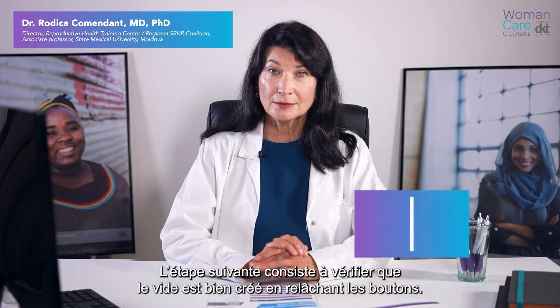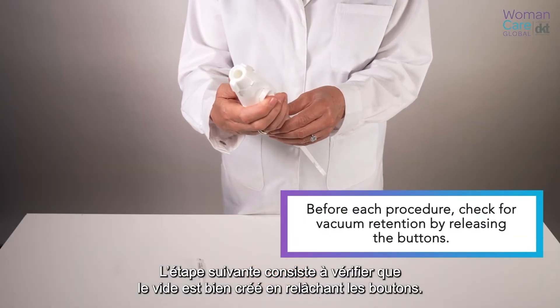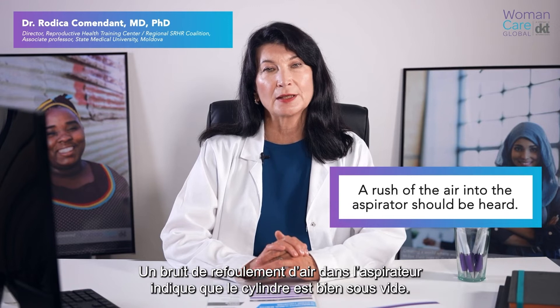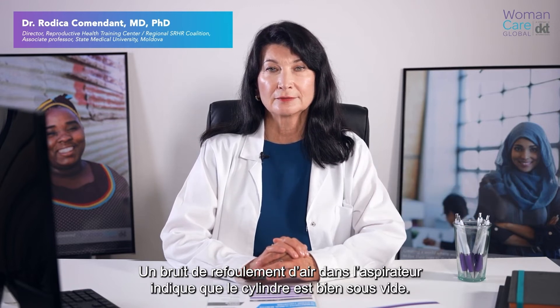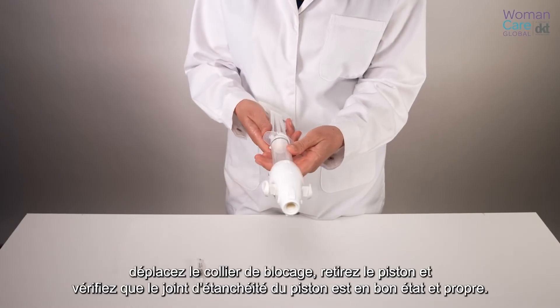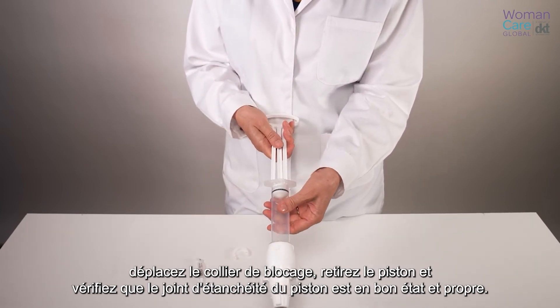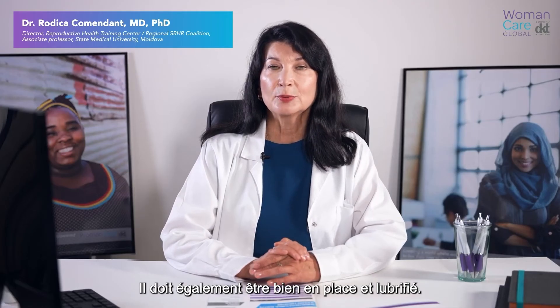The following step is to check for vacuum retention by releasing the buttons. This should be done before each procedure. A rush of air into the aspirator should be heard, indicating that the vacuum was retained. If the rush of air is not heard, remove the collar stop, withdraw the plunger, and check that the plunger o-ring is not damaged and is free from foreign bodies. It should also be properly lubricated and positioned.